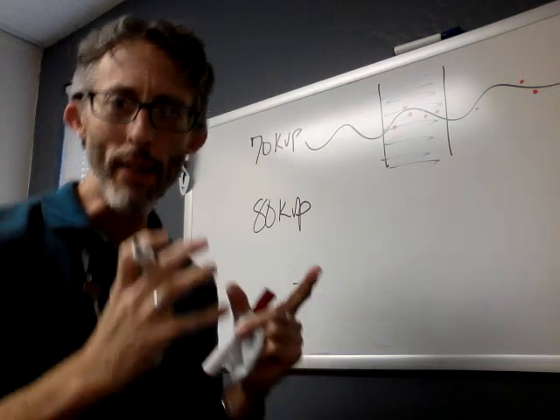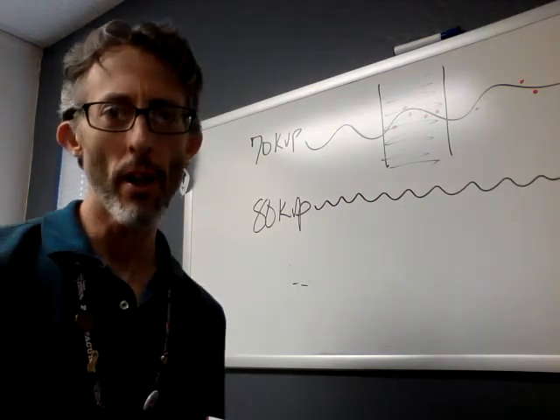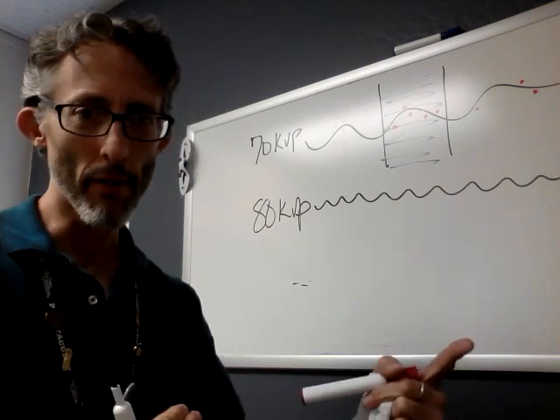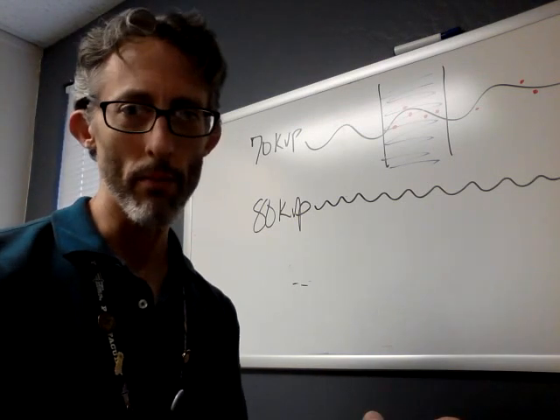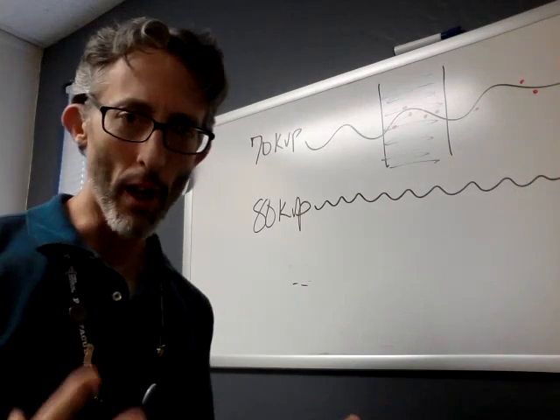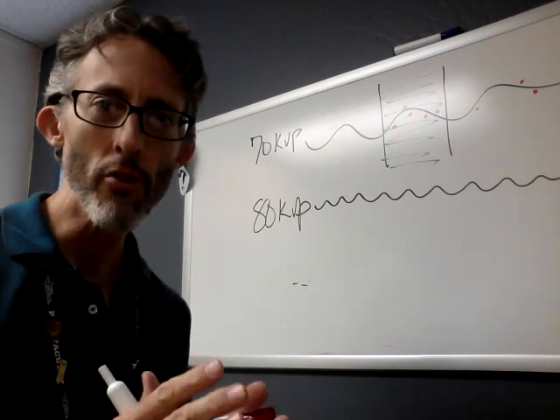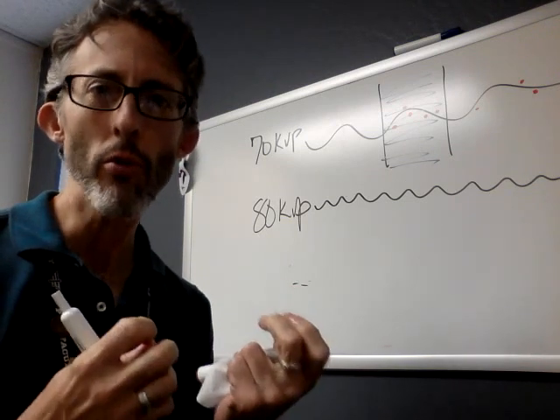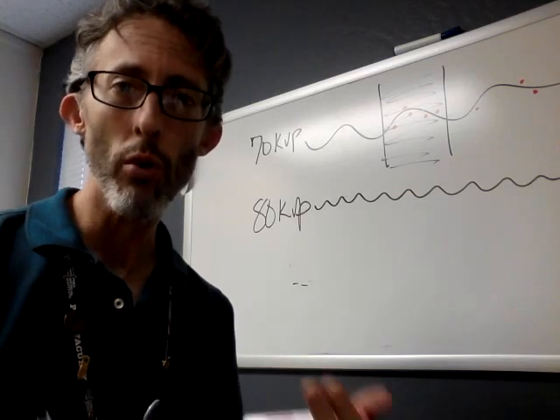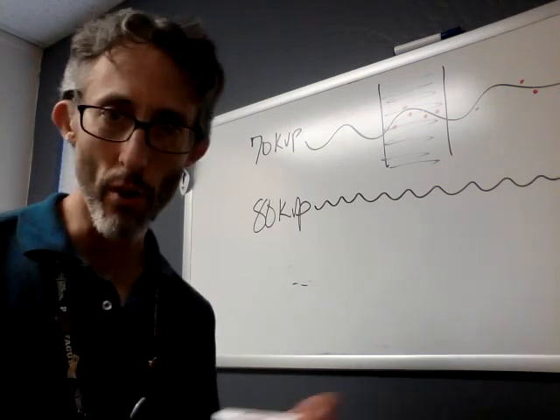the energy of the beam increases and it looks something like this. More energetic. Same velocity, keep that in mind, it's important. Same velocity, speed of light. That never changes with X-rays. Never, ever, ever. Whether you have a super low kVp or a really high kVp, all those X-rays are going to be moving with the same velocity. They're moving at the speed of light or they don't exist. What's changing is the characteristics of those photons, how energetic they are, what they're able to do for you. And in this case, we're talking about penetrating with less attenuation through the tissues.